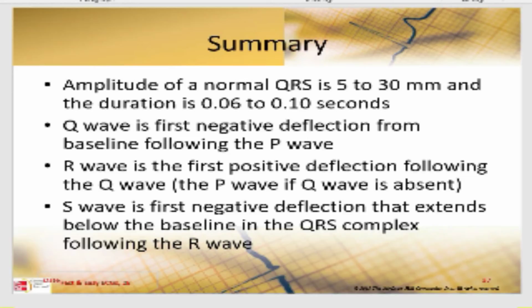The amplitude is 5 to 30 millimeters, and the duration is 6/100 to 1/10 of a second.